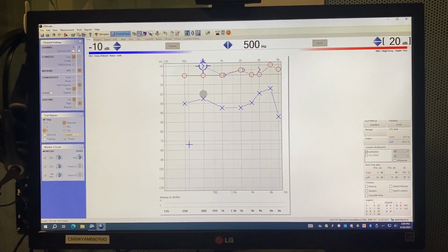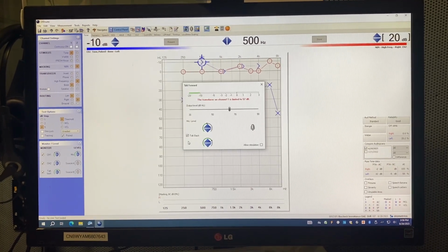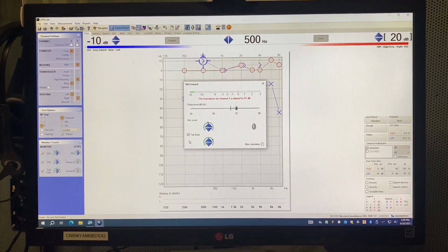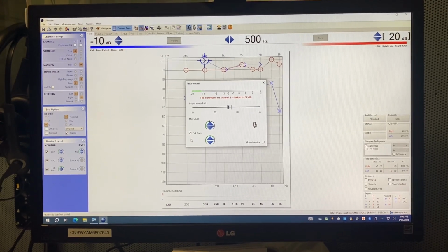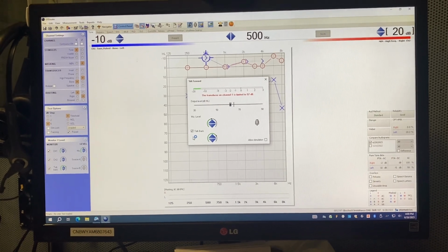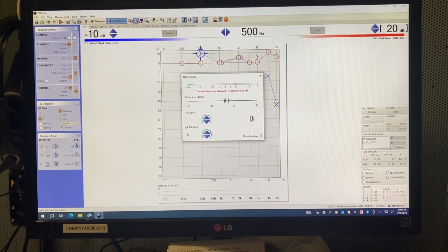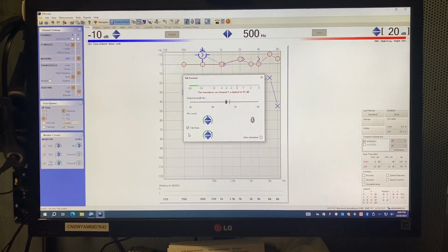And we are going to tell the patient that you are going to hear some noise in the right ear. Just ignore it. We're just keeping that ear busy while we see how the left ear hears. Only respond to the beeping tones and just ignore that noise.